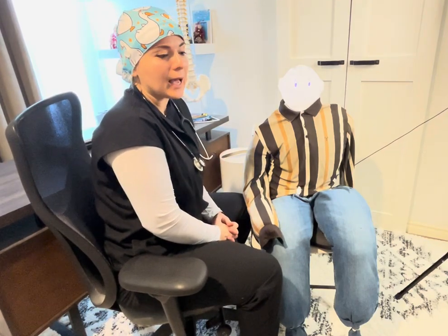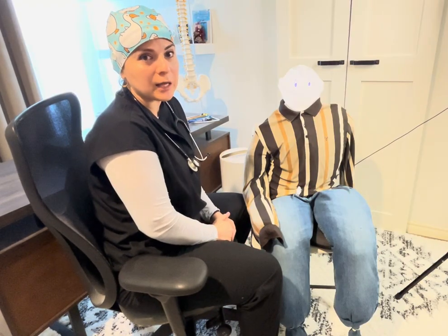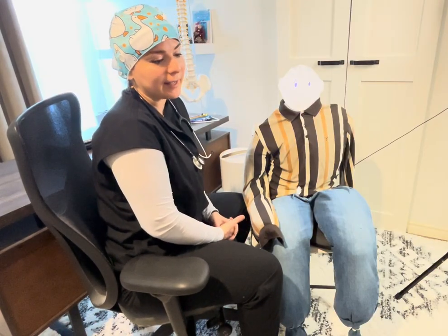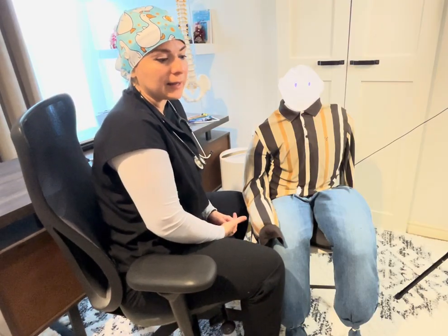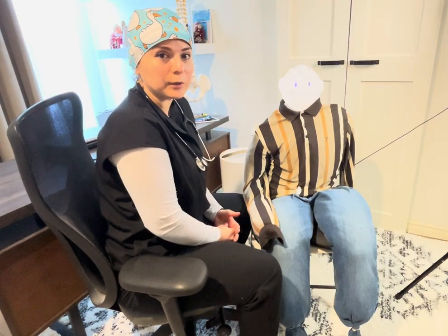Hello everyone, welcome. In this video I've decided to show you how to perform a blood pressure skill on your patient. As a nurse, I know you have access to automatic equipment to check blood pressure, but you need to know how to manually perform this skill — it's very important.